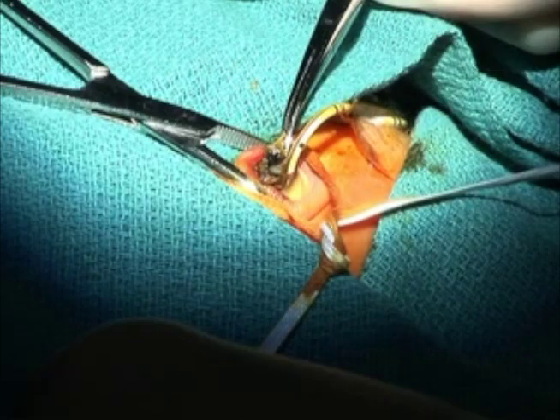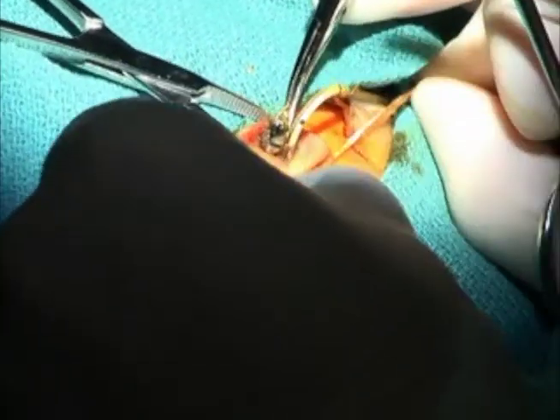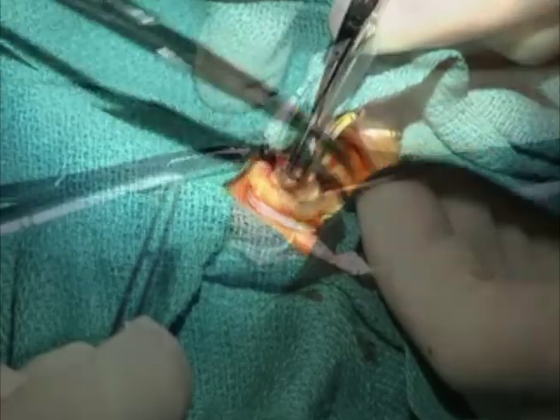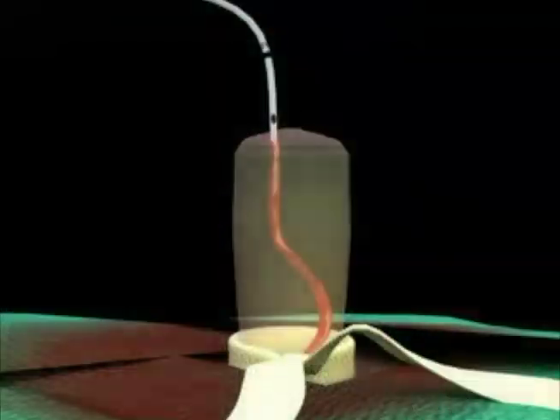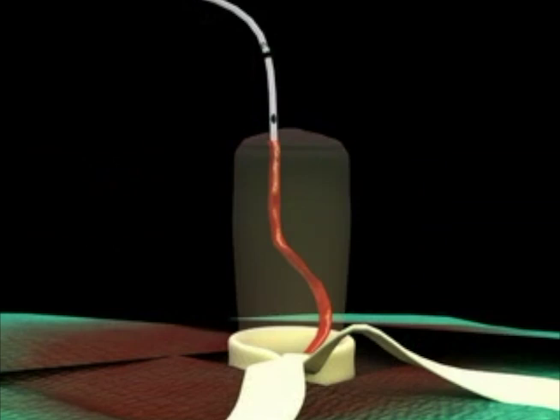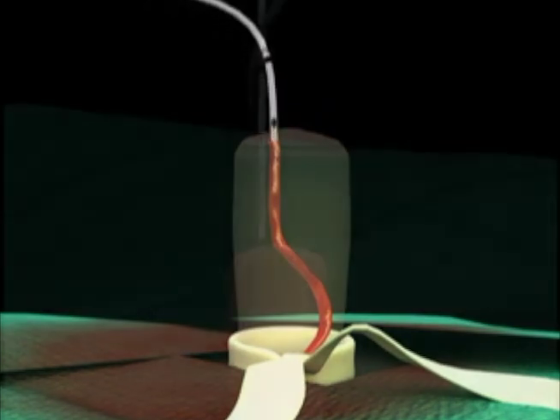There are several stages at which you may encounter difficulty with insertion. If the catheter threads to only 3 centimeters, the umbilical tie may be too tight. Loosen the tie, redilate the vessel, and reinsert. If insertion is easy but there is no blood return, or if you sense a pop after entering the lumen, the catheter may be in a false track outside the vessel. Remove the catheter and prepare the other umbilical artery for insertion.